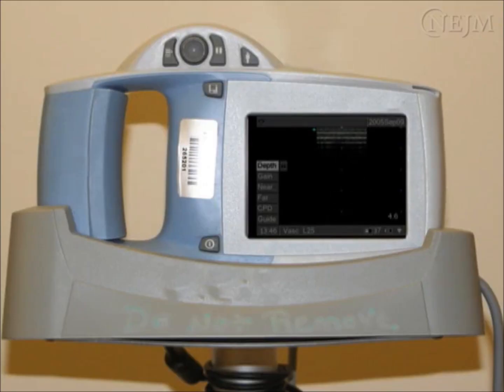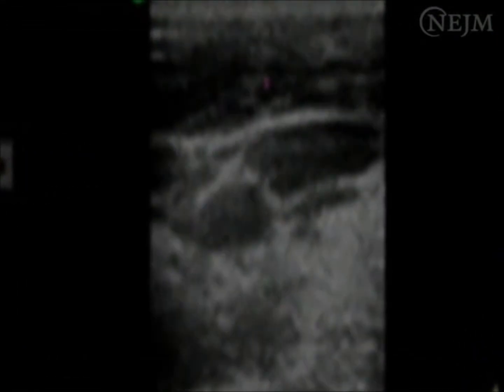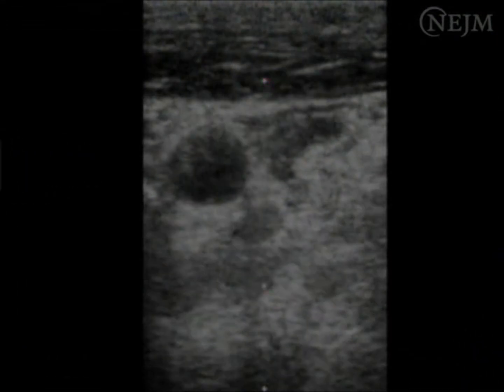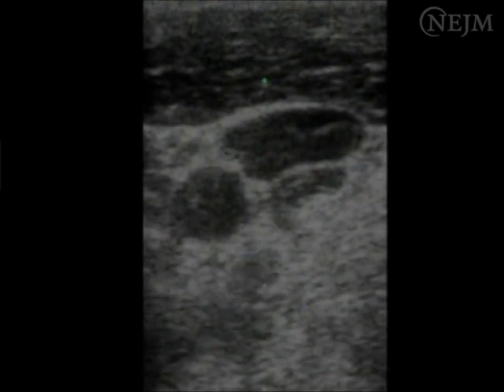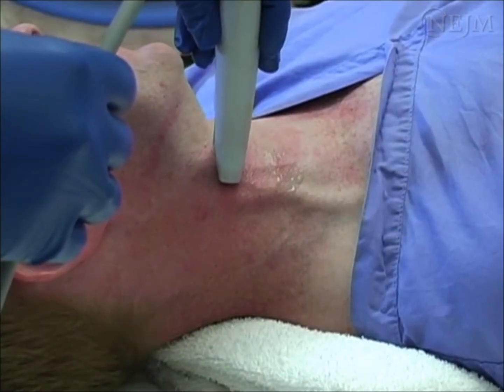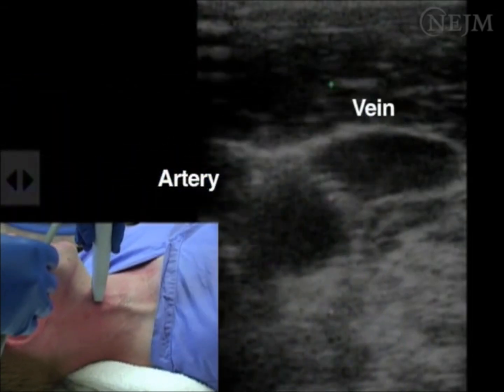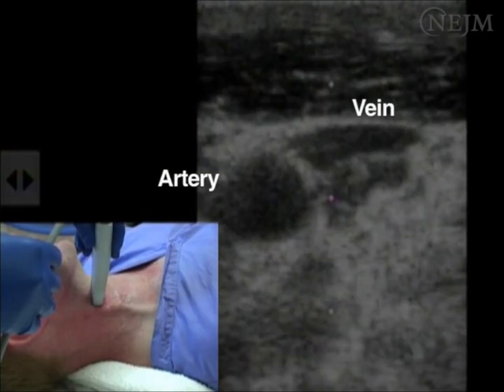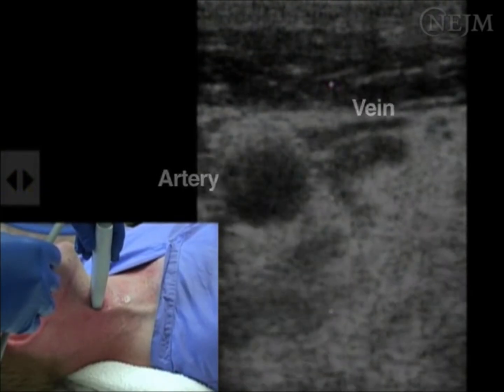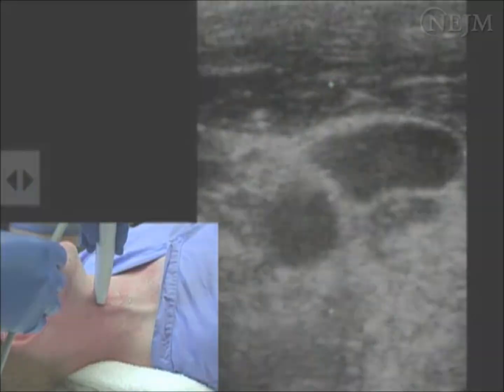Ultrasonographic guidance is becoming the standard of care in the placement of a central line. It can help to illustrate aberrations in the anatomy, facilitate rapid placement of the central line, and decrease the risk of inadvertent arterial puncture. To identify landmarks with the use of ultrasonography, the probe is placed directly on the needle insertion site. The vein and artery are identified on the image as circular and black. The vein is identified by applying gentle pressure with the probe. The non-muscular vein will collapse easily, whereas the artery will remain relatively circular.